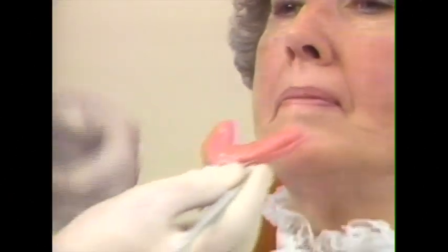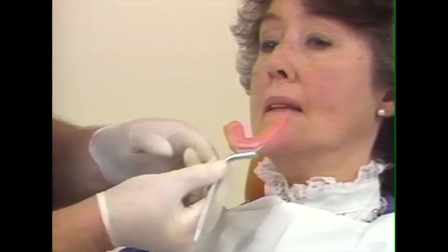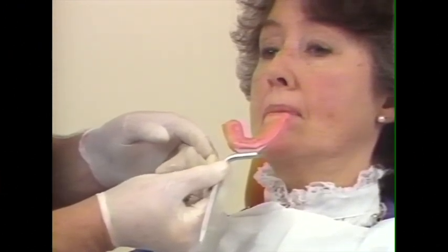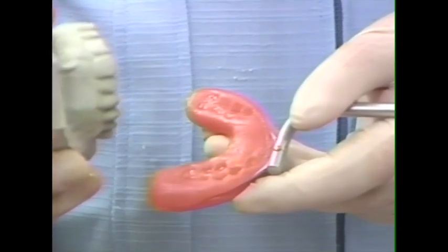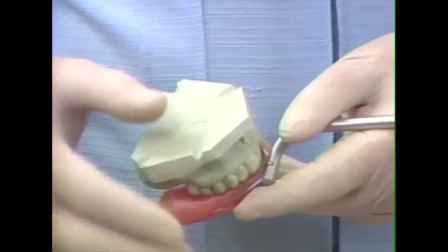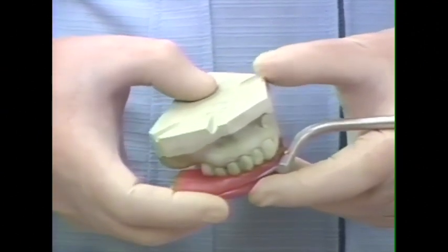and inspect our record. Here we have good indentations of the maxillary teeth, and the mandibular teeth have not penetrated through the wax, so that the record could be distorted if it had been penetrated. It's very important that the cast or the occlusion rim be tested into the record after it's chilled to ensure that it is very stable. An unstable record will not have proper accuracy.